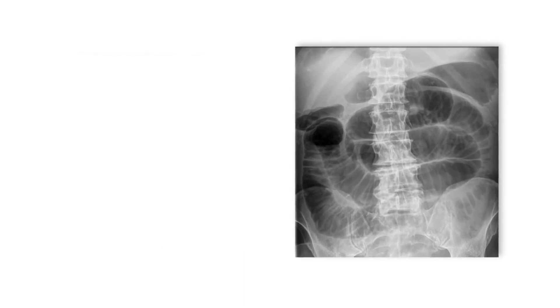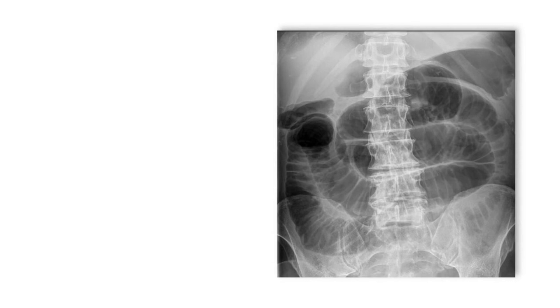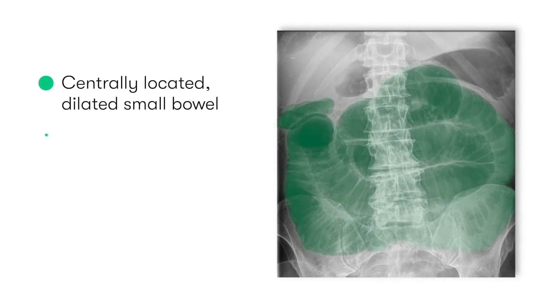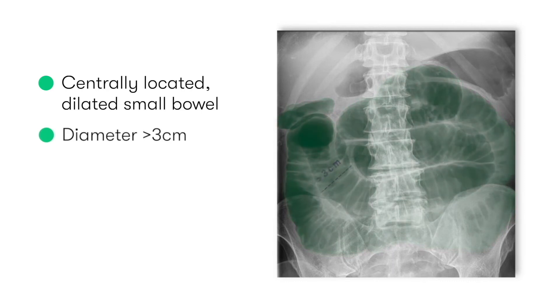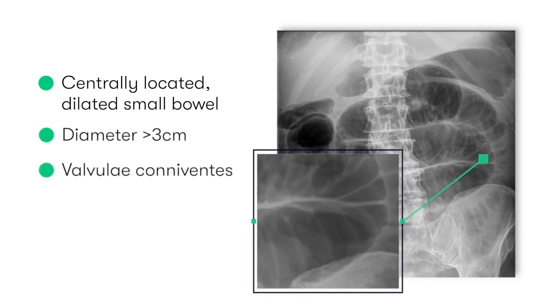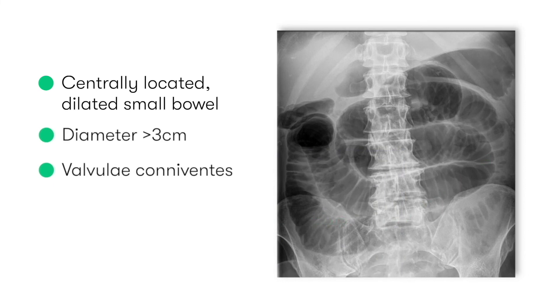Looking more closely, in abdominal x-rays of small bowel obstruction, the features we normally expect to see are centrally located dilated small bowel with a diameter of more than 3 cm. We can tell that these loops of bowel are in fact small bowel rather than large bowel due to the presence of valvulae conniventes, which are near-circumferential folds of mucosa visible as lines that traverse the diameter of the bowel. An additional feature that we may see on abdominal x-ray is the presence of fluid levels within the dilated small bowel loops.